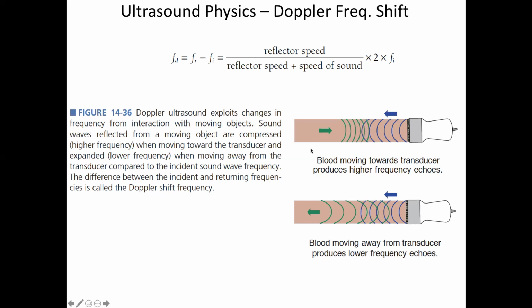In Doppler, where we do pulsed mode Doppler, there's a factor of 2 involved for this jump in the frequency of the sound, and that is because if we didn't reflect anything, if it was just an emitter coming at us, we'd see a shift in frequency proportional to its velocity. That's actually not what happened. We transmitted sound at it, right? And so when it received the sound, it also got shifted up in frequency, as it's a receiver. And then it retransmits, and it goes up again in frequency.